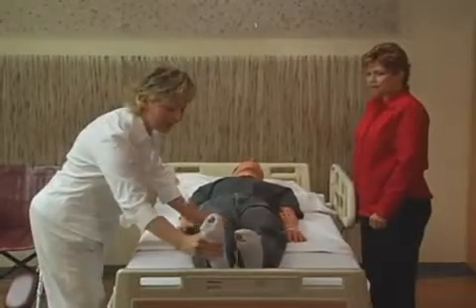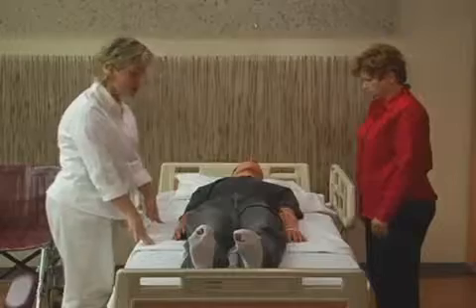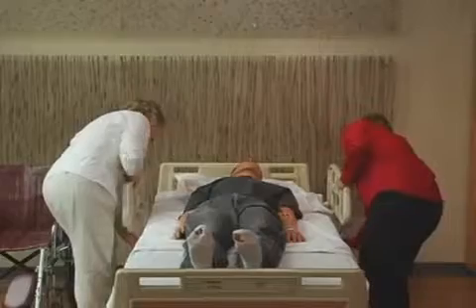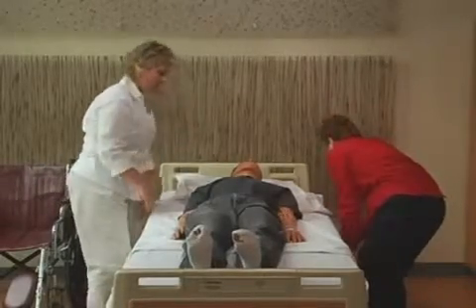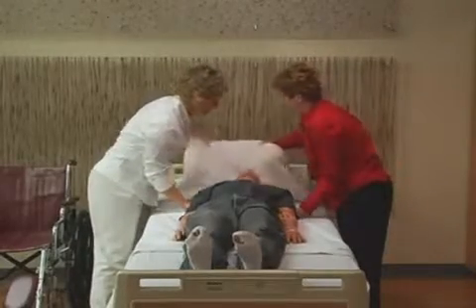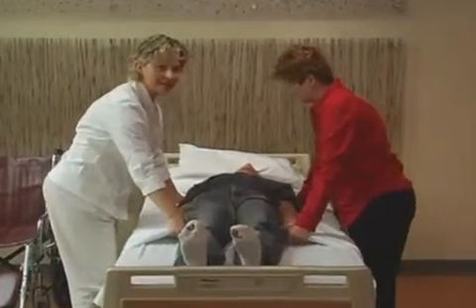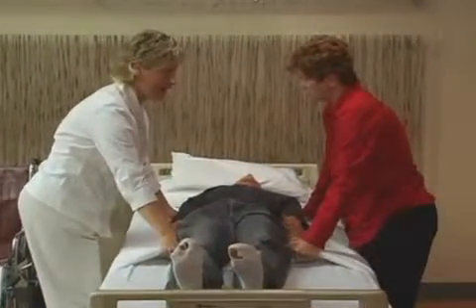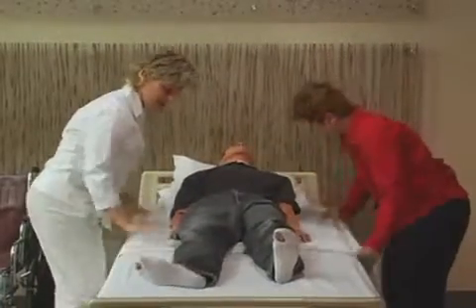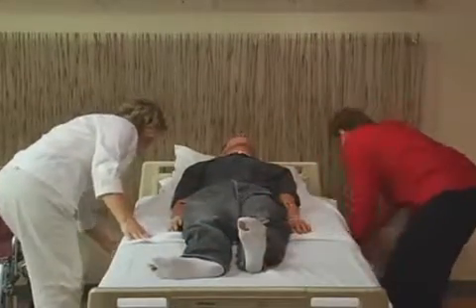We have Victor here in bed, and we're going to move him up. He's slid to the end of the bed. He's on his draw sheet, and this is what we use a draw sheet for. Put the sides of your bed down first, and we'll have to move him up higher in the bed. Get his pillows ready. Now get in here and get close with your hands right next to his body so you can lift him without straining your back. So we lift and slide up. Once he's in place, you can put the rails back up.